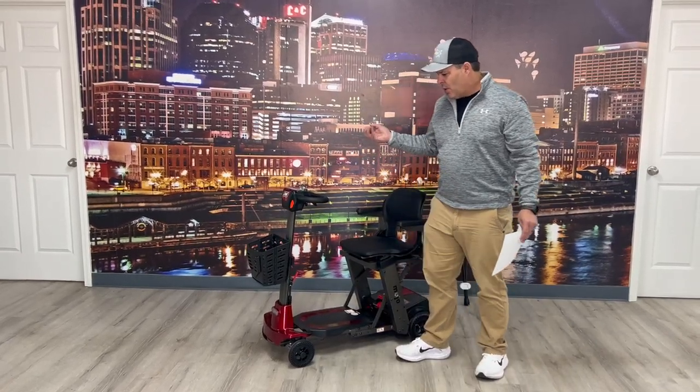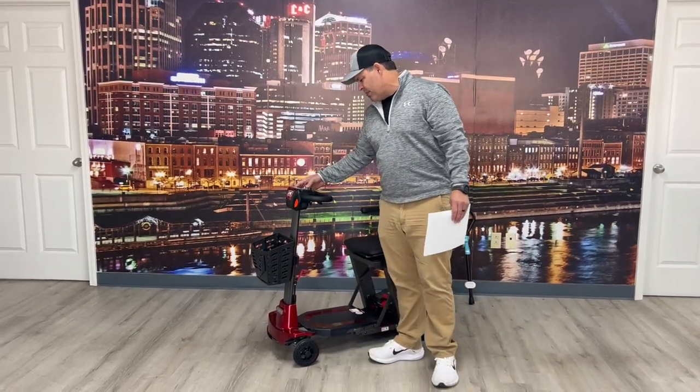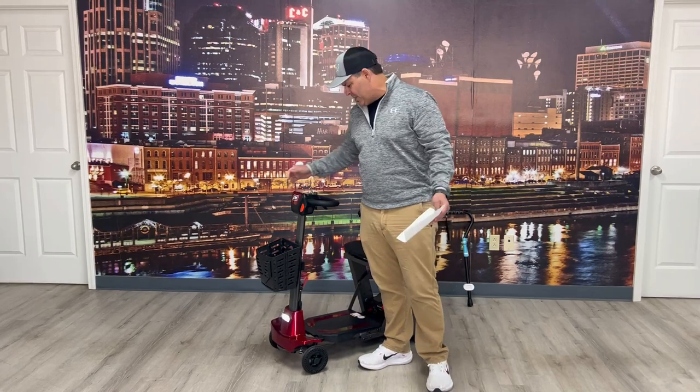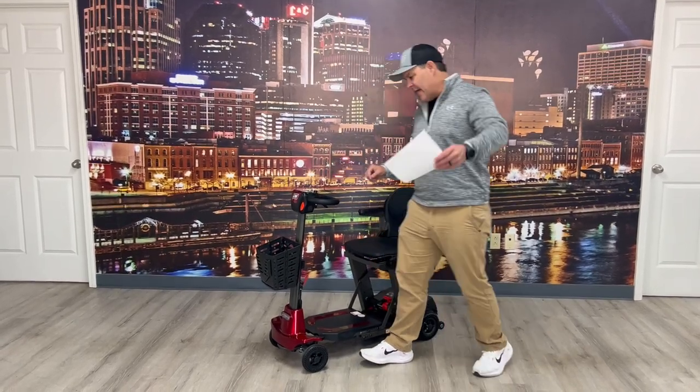Now you're ready to go. You've got a front basket here — I'm going to put the key fob in there. You have a horn, and there's a light up front. It's not bad, pretty basic. You have your basic speed dial — come over here and I'll let you see the system.